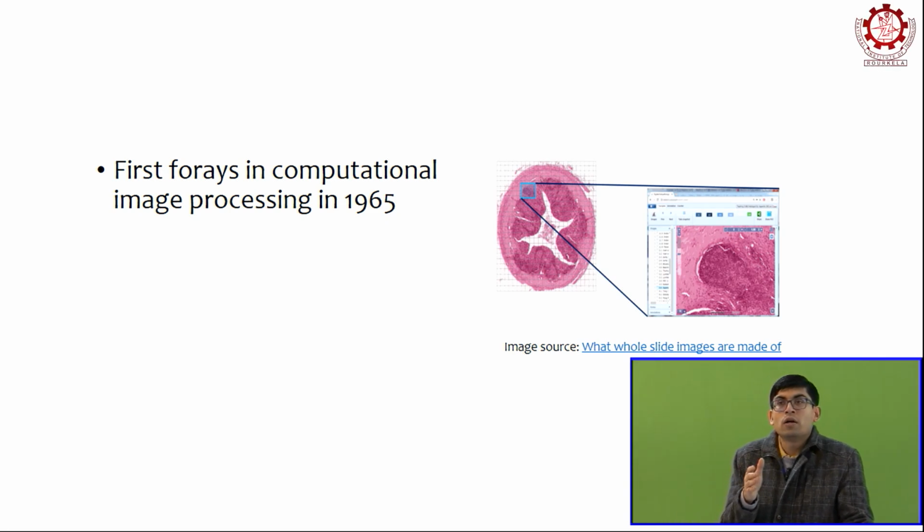And obviously it did not happen just by itself. A lot of it was helped by the AI boom, right? You have a lot of compute infrastructure now, different GPU servers, and processing of these images has become a lot faster. So all of that has aided digital pathology. It all comes down to the fact that it's a collaborative thing. You can't just stand up a digital pathology unit by itself. You need the buy-in of the hospital IT, so that they can invest in compute infrastructure, so you can have enough GPUs and enough compute power to support these kinds of activities. You need specialized hardware. It's not just that you take a camera and digitize it.